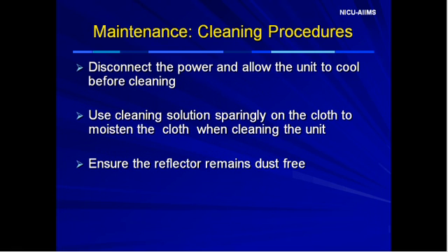Disconnect the phototherapy unit from the main power input and allow the unit to cool before attempting cleaning, in order to avoid the possibility of burns. Soak the cloth sparingly with the cleaning solution mentioned by the manufacturer or the unit's own protocol, just to moisten the cloth. Excessive cleaning solution may spill inside the unit and damage the electrical and electronic circuits inside.